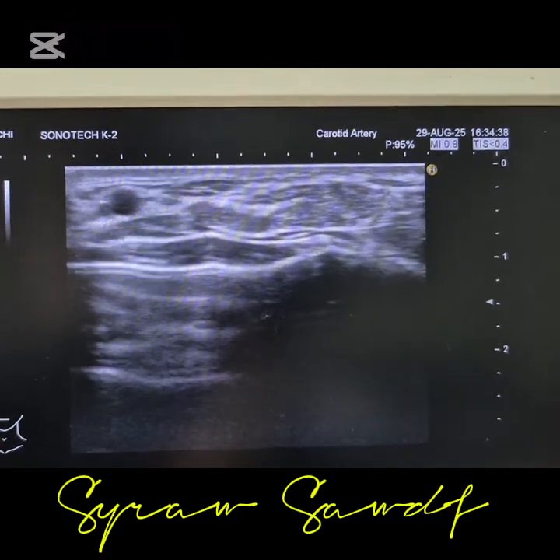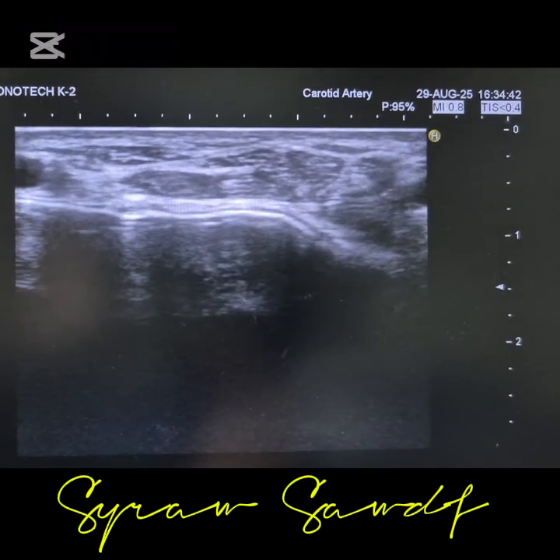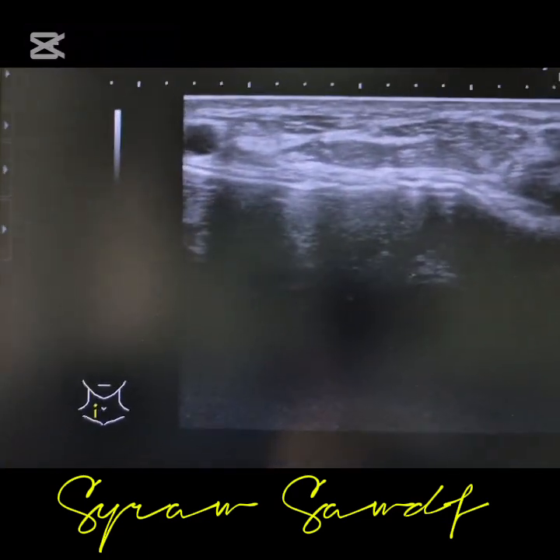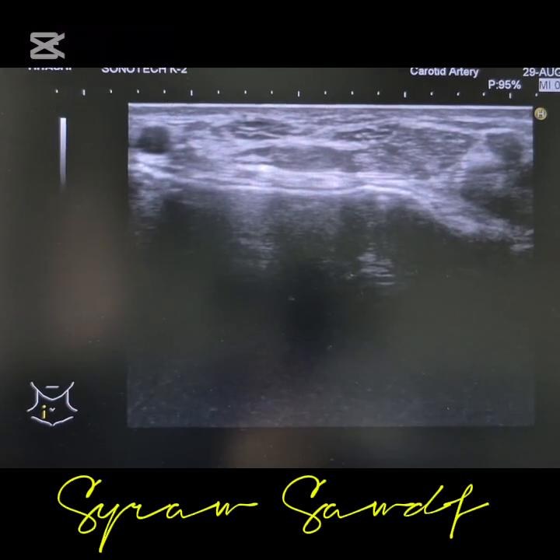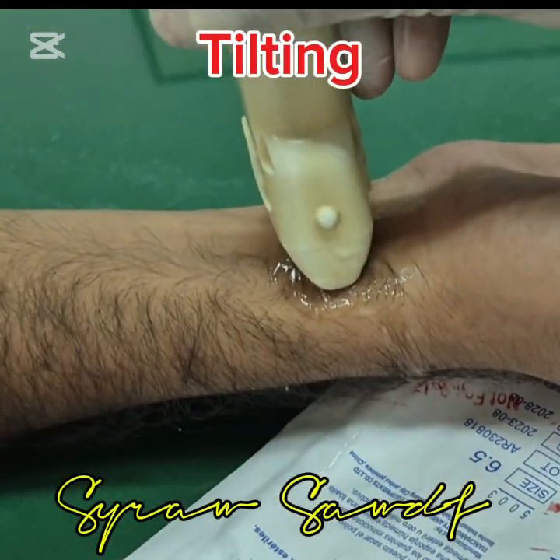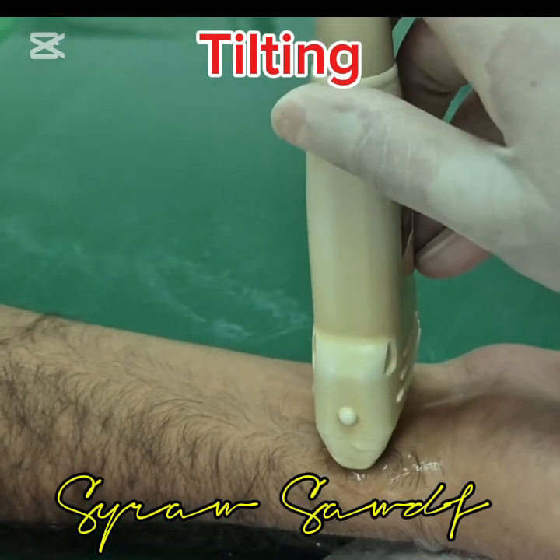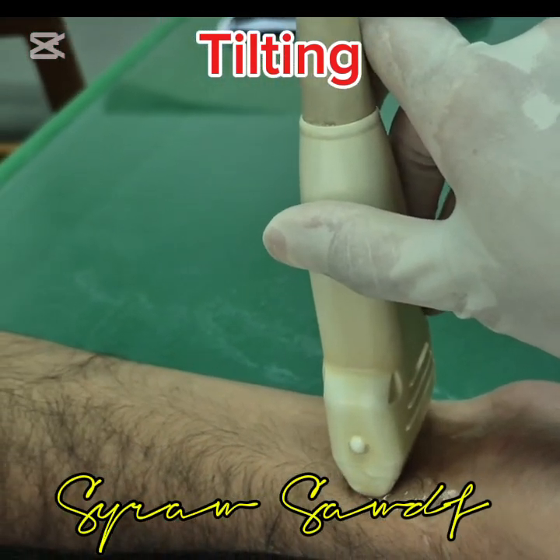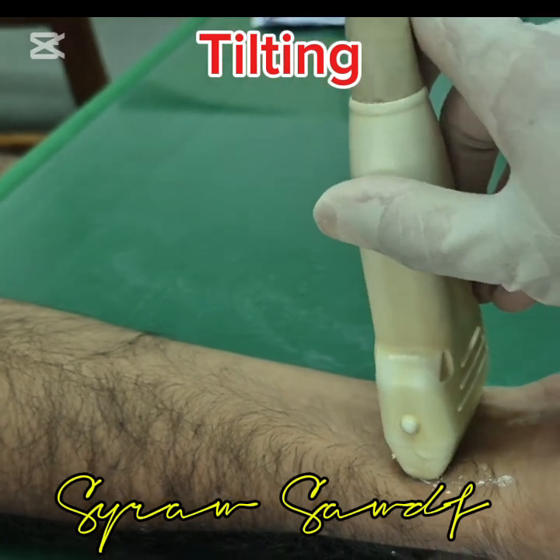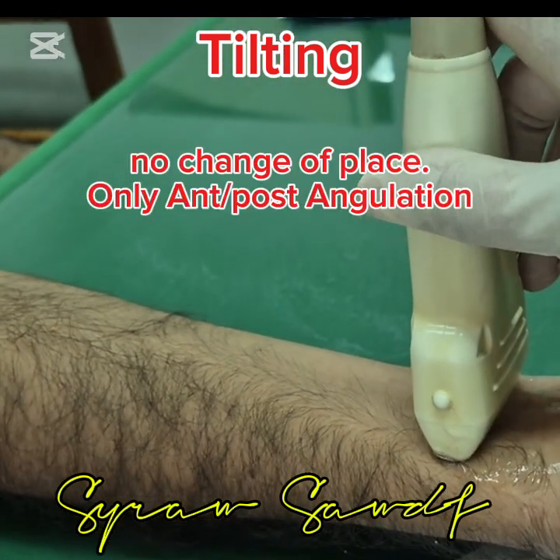Again, I am rotating my probe from longitudinal to the transverse. Now you can see the cross-sectional image of the structures. Let me show you what is tilting. Keeping the probe on the same place where we are not actually moving the probe, we are just giving a little angulation to its placement. This is known as tilting.